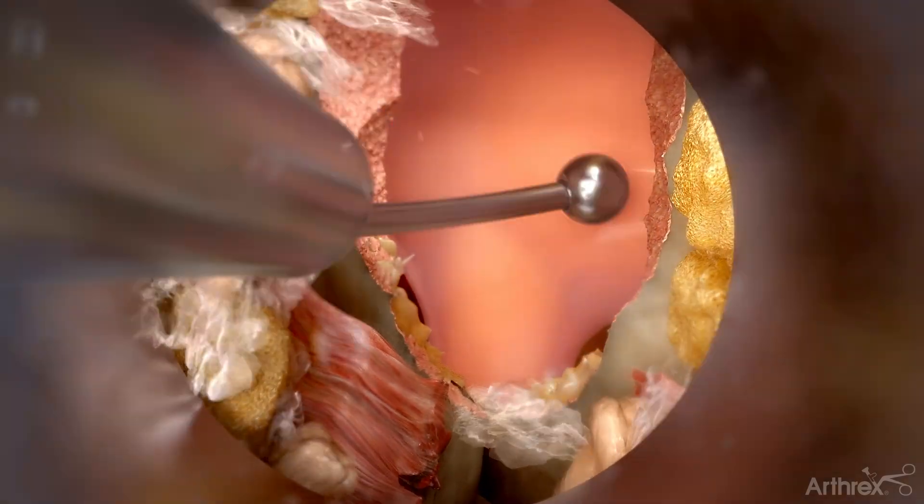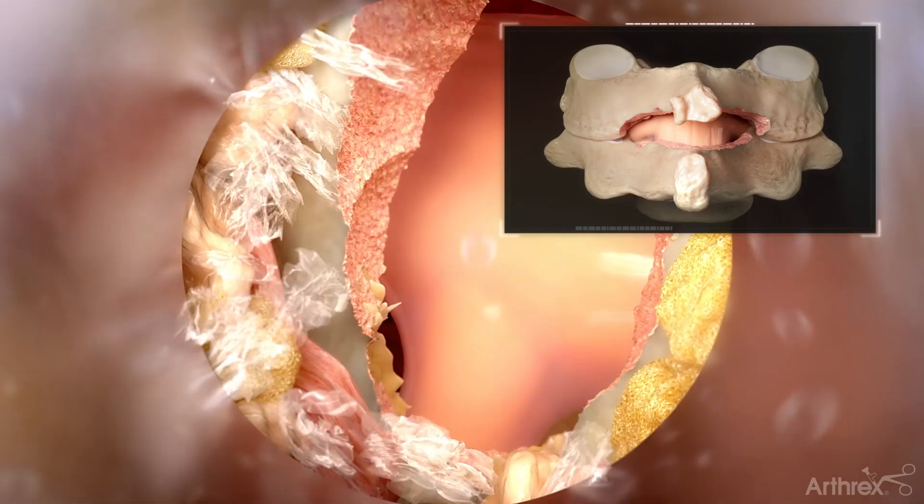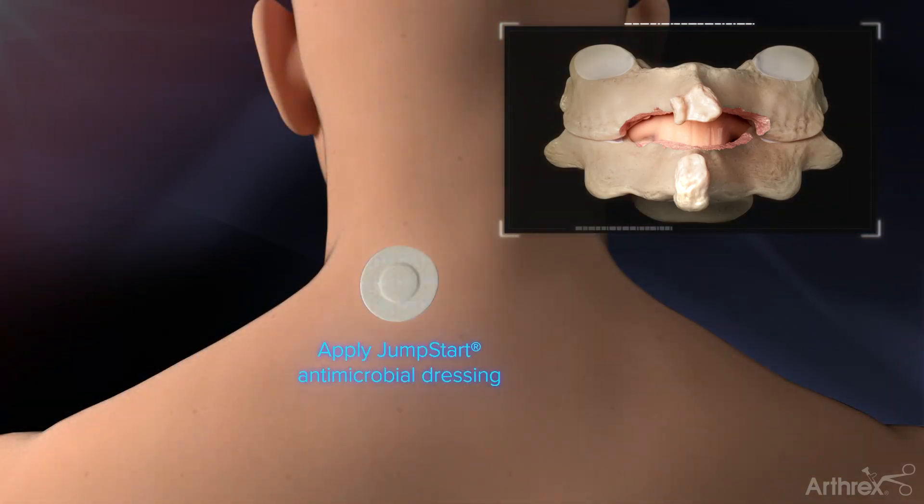A ball tip probe and direct visualization can be used to assess the decompression. Once complete, the endoscope and cannula are removed, followed by wound closure and placement of a sterile bandage.